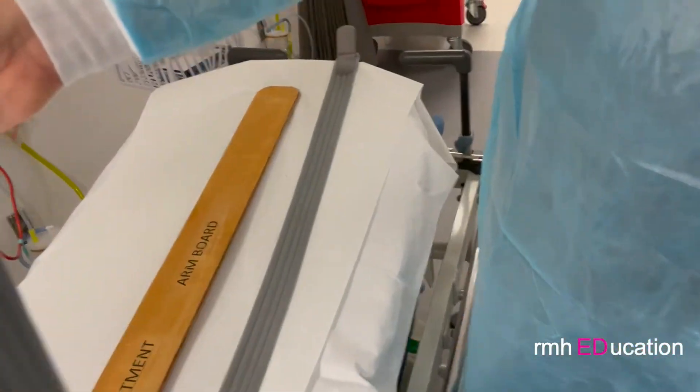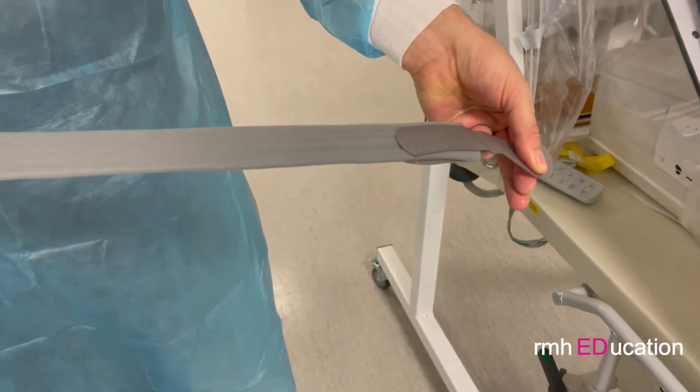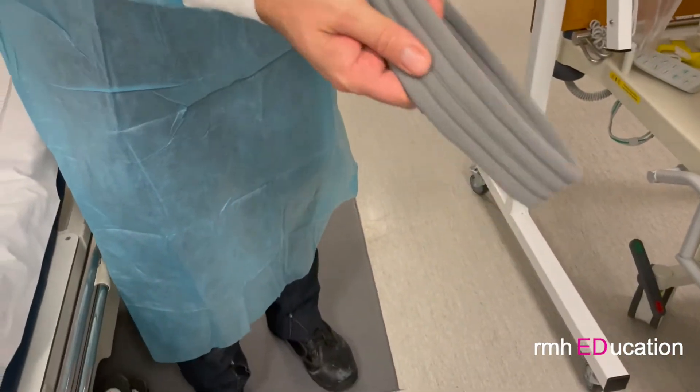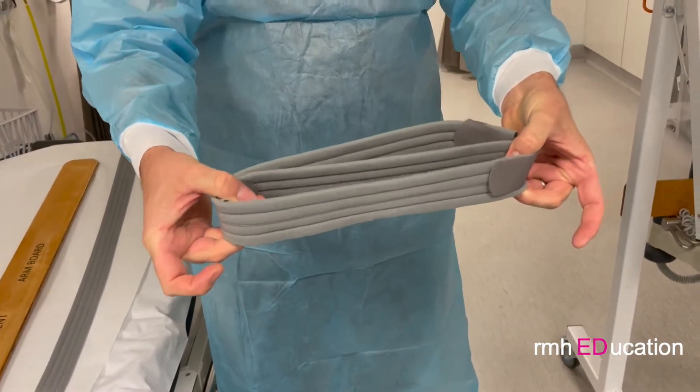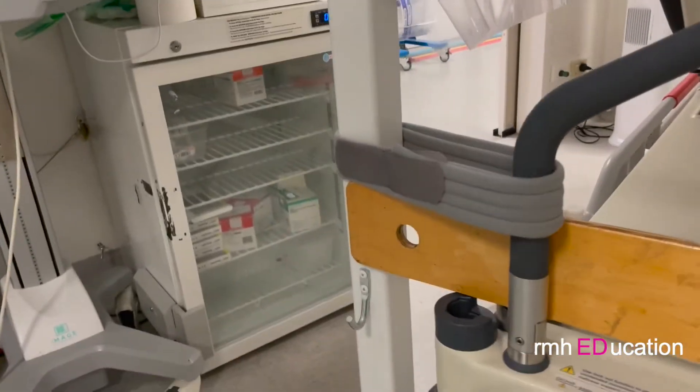This piece of Velcro facing out, this piece of Velcro facing down, and then when you wrap it around, you wrap it around there, put one on the other side. That's very easy and disposable.